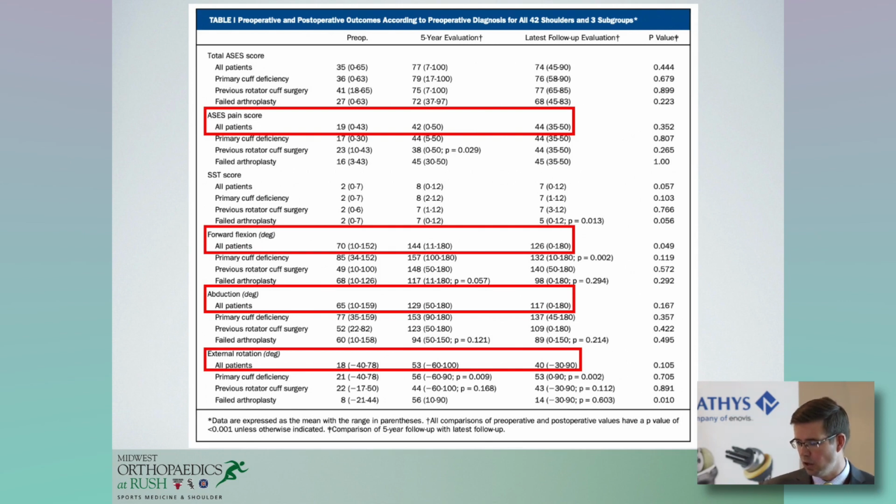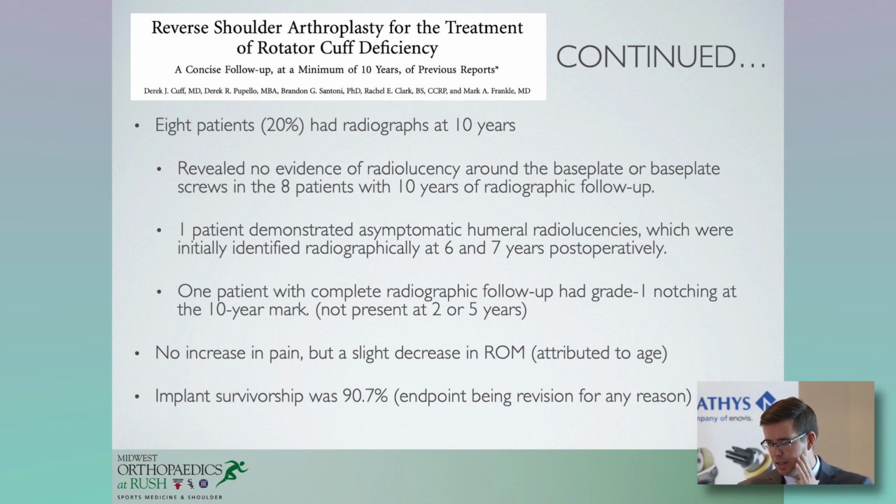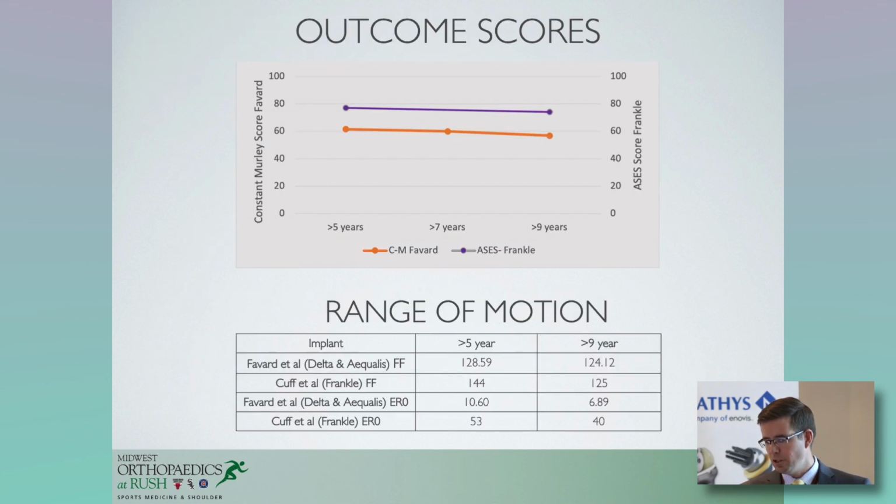So they still had 126° of flexion, and most importantly, the implant stayed in place. Its radiographic follow-up looked good. It's hard to compare the 10-year data with the Grammont design from Favard at all, because, as Europeans are aware, the Constant-Murley score is the standard shoulder score here in Europe, and in the United States we use the ASES score, and you really can't compare those.